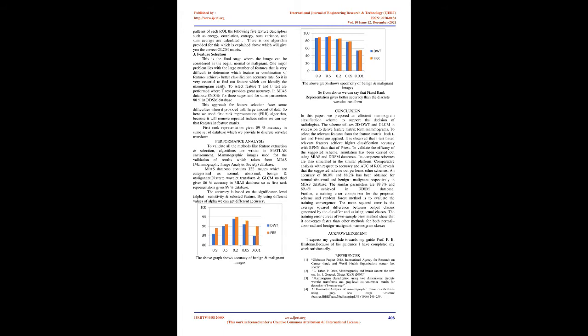Proposed system. The proposed system approach consists of 2 main algorithms: feature extraction and feature selection. The feature extraction algorithm concentrates on the texture of the mammographic image utilizing 2D DWT and GLCM in succession on the region of interest, ROI, to find the feature descriptors of each detail coefficient of 2-level DWT. In the feature selection algorithm, effective and significant features are selected and provided to the neural network for the classification of mammograms as normal, benign, or malignant.